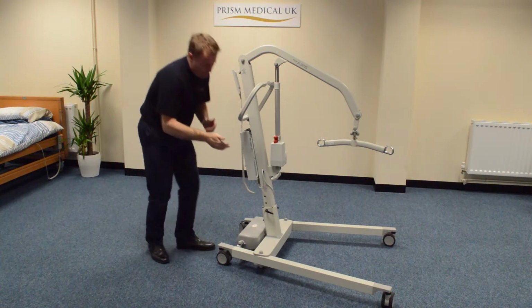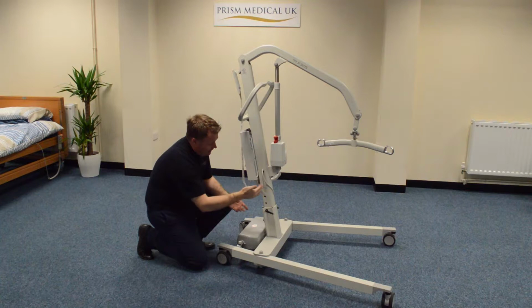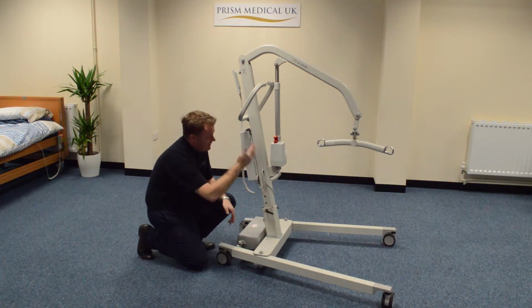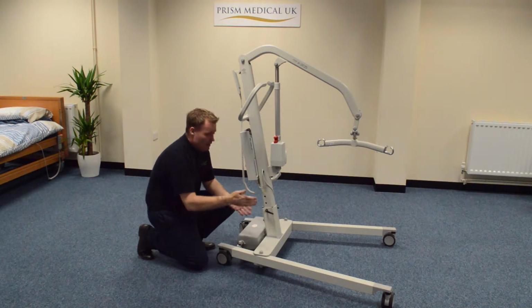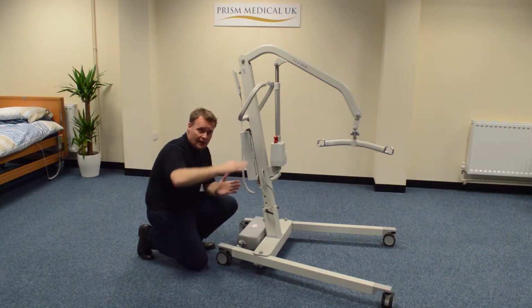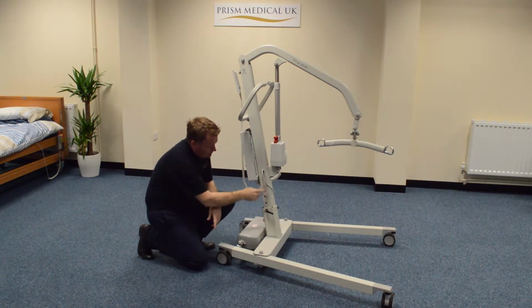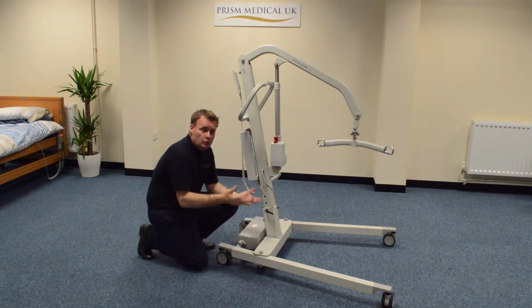Also on this hoist, we have an adjustable height mast. In its current configuration, the mast is in its highest position. This enables us to lift from a chair onto a changing bench or similar kind of height stretcher. Also, we can put it down to its lowest position, which would enable us to hoist from the floor onto a chair.